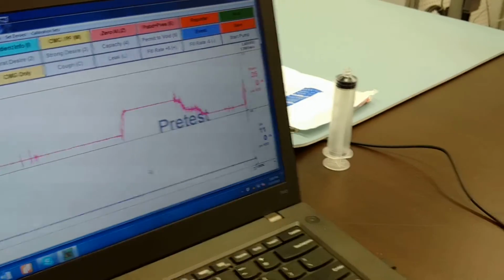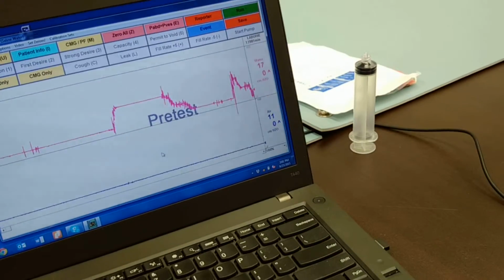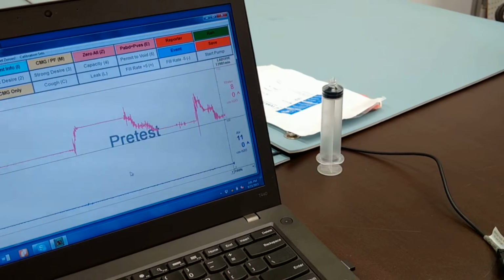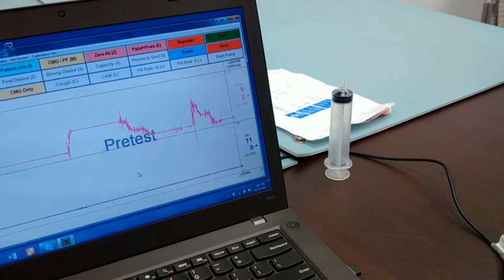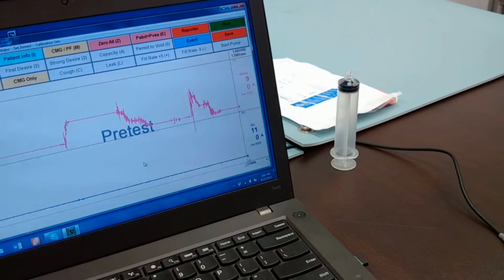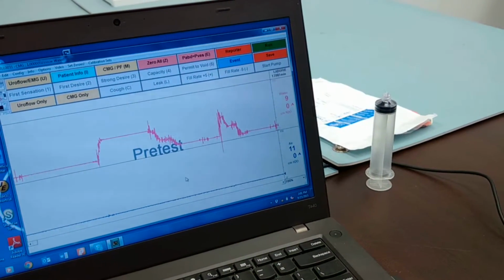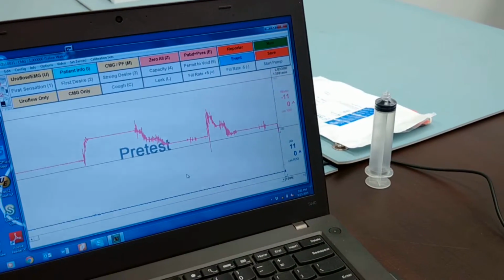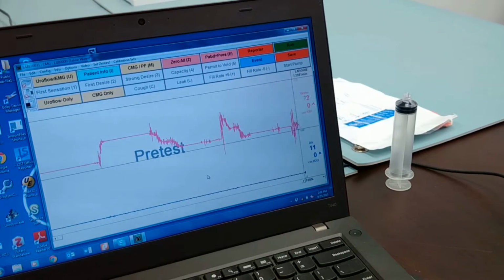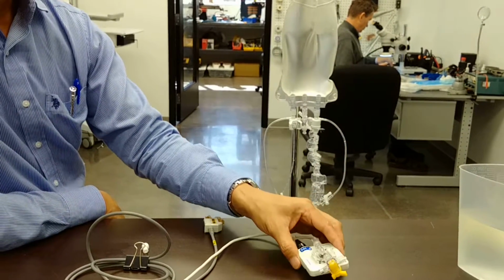And once again, when a patient sits down, again, to another location, it doesn't really matter what that number really is, we go back and we take a look at, well, we know that the water transducer on the outside has to be about here. Okay, because the two numbers must match up. And if you take a look at what's happened, the height of this transducer, height of symphysis pubis, it looks pretty much dead on. Okay? So I should be able to track this position to this bladder neck, even if I can't see the bladder neck, simply by looking at the urodynamic results and matching two sets of numbers.